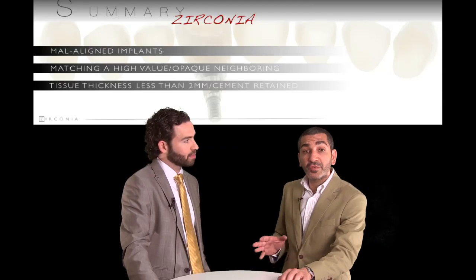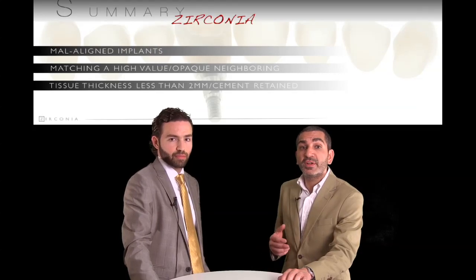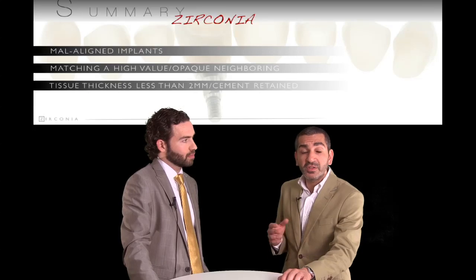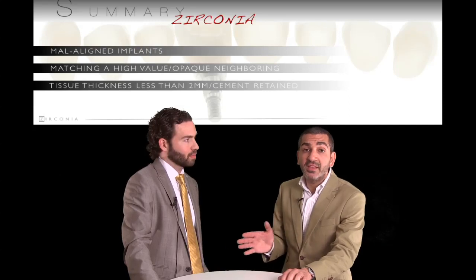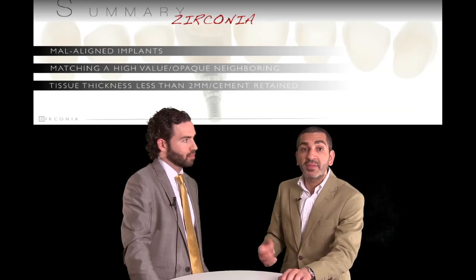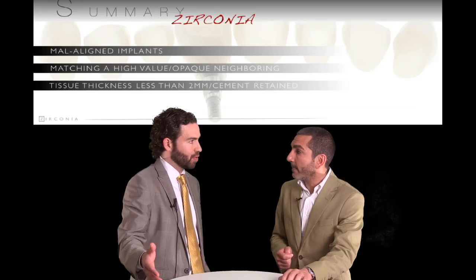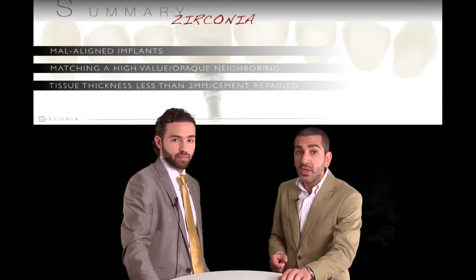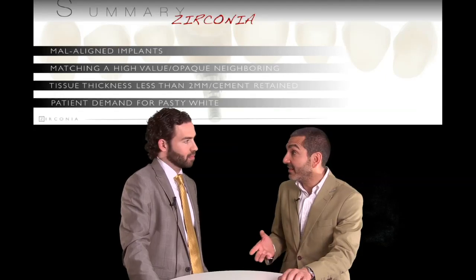Please also consider the soft tissues when using zirconia abutments. That plays a huge influence on the way your final restoration will look. It's important to consider the thickness of it. As long as you have a thickness of more than 2 millimeters, you pretty much will be able to mask anything that goes on in terms of screw shape, form, size, and color, or the abutment color, or the zirconia color, in fact. So less than 2 millimeters probably is best to use zirconia-based restorations for better aesthetics. Exactly. If you have thin soft tissue, I would recommend using a zirconium abutment. That would be the safest in terms of aesthetics, at least.